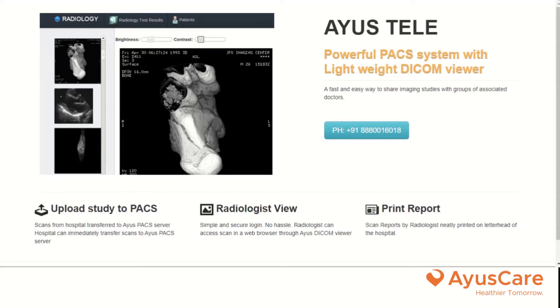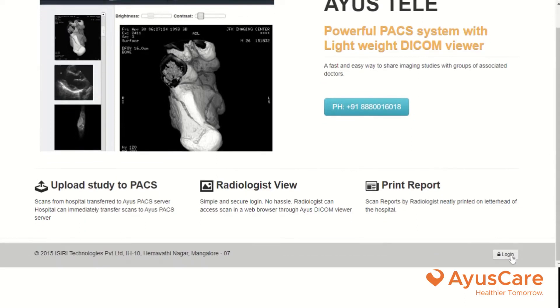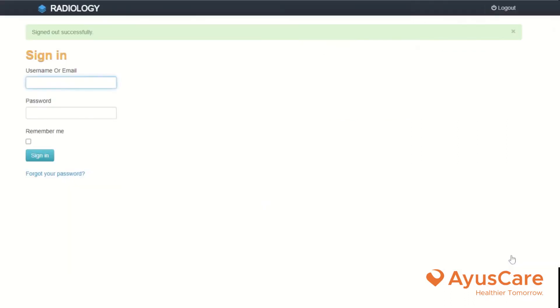Welcome to Ayushkar. I am here to present the Powerful Pax System with LightWide Dicom Vivo. Initially, we will login to the system with the username and password.